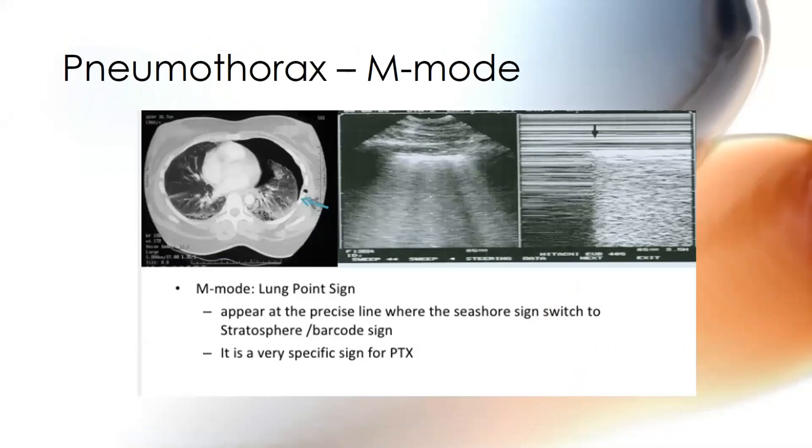You're like, I'm so tired of hearing about pneumothorax. Okay, we have a very moderate to large size pneumothorax as shown here on the CAT scan, right? All this air, and my lung has shriveled up. Do nothingness. This person also has some interstitial lung disease. Lovely. So I put the probe marker here, laterally and posterior. This is the PLAPS point, posterior lateral point here.